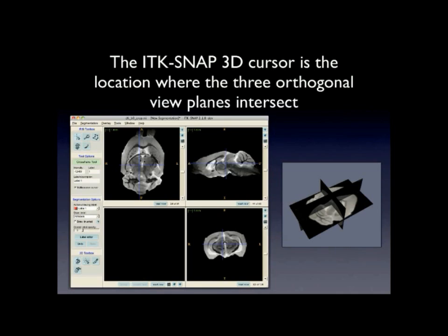Think of each one of those crosshair lines as there being a slice like this and a slice like this coming out of plane. As if you were looking at this 3D picture head on, the blue lines represent those slices that are sort of coming out of the screen.